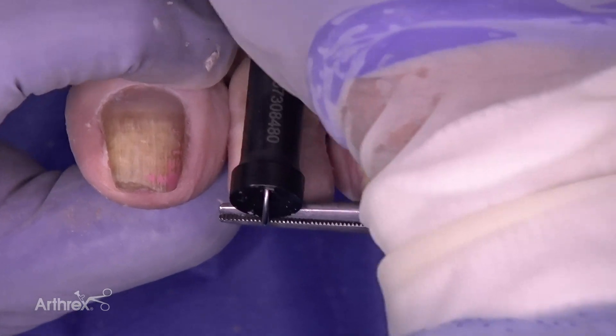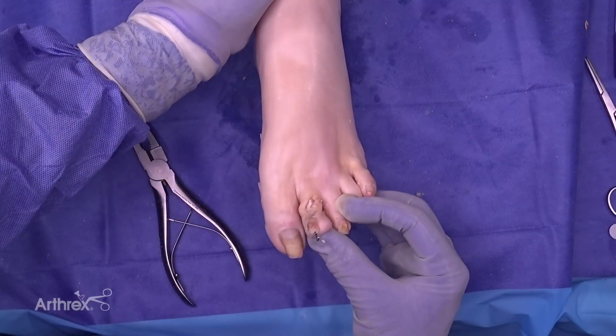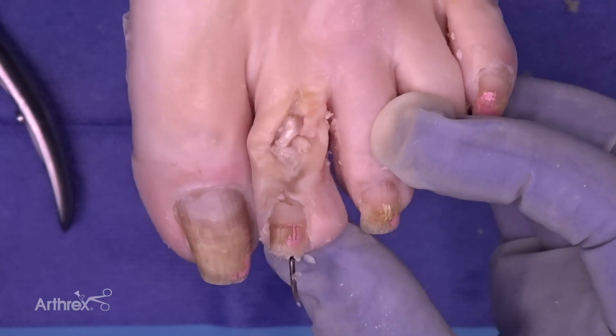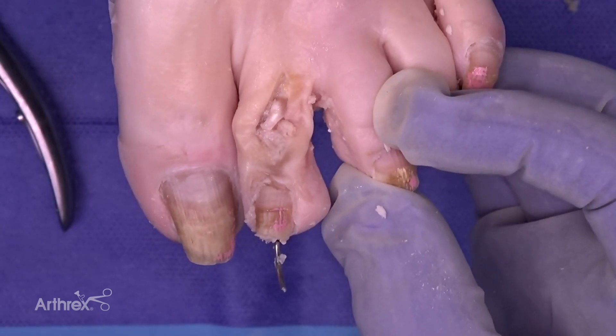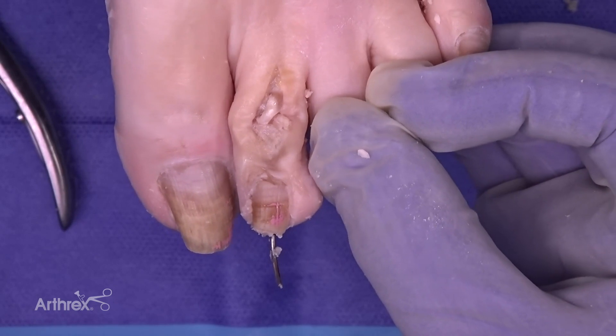What's unique with this particular implant and wire is that we can move the MTP joint up and down, and the flexible end of the wire will return to its original position while still maintaining stability at the fusion site at the proximal interphalangeal joint.